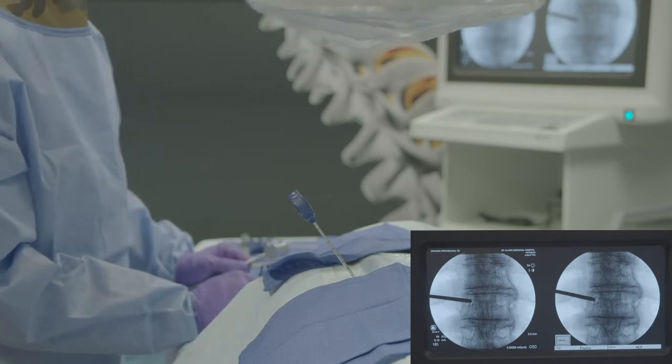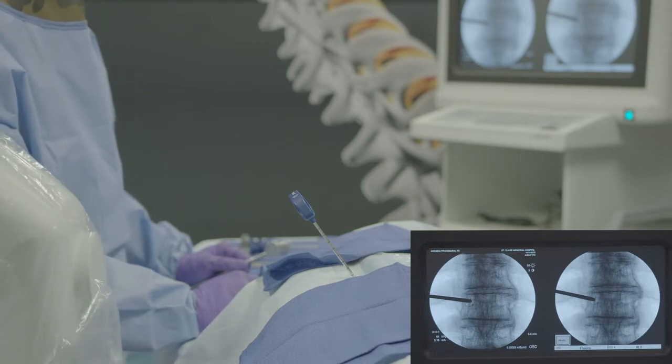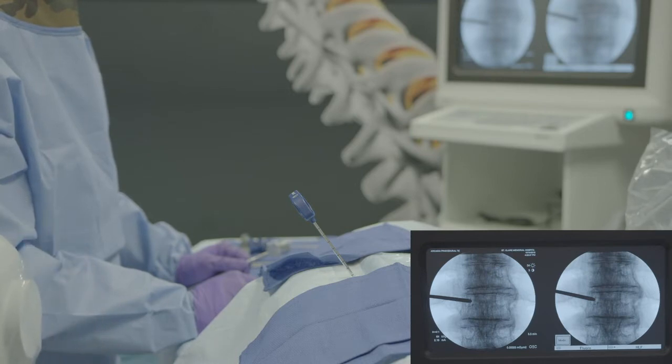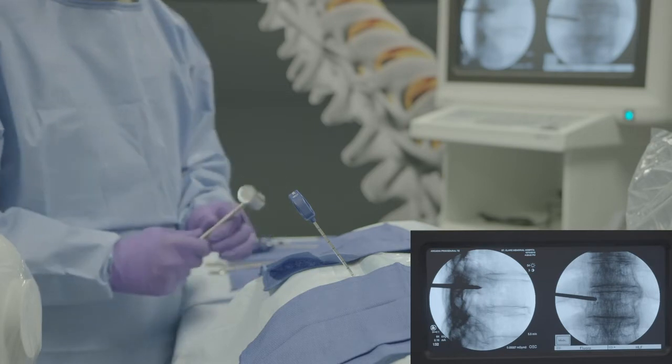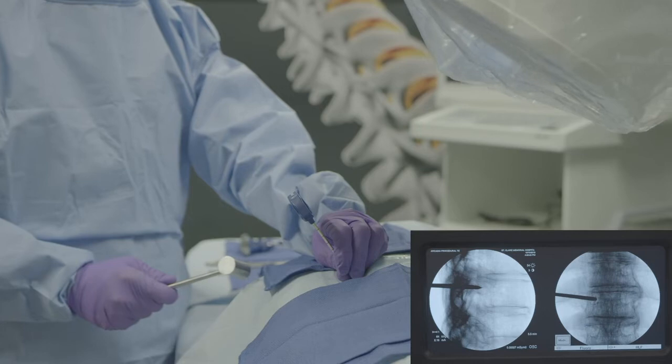In the lateral view, verify the access introducer is mid-pedicle. In the AP view, advance the access introducer to the medial border of the pedicle.